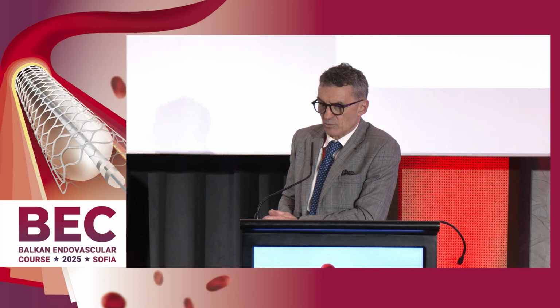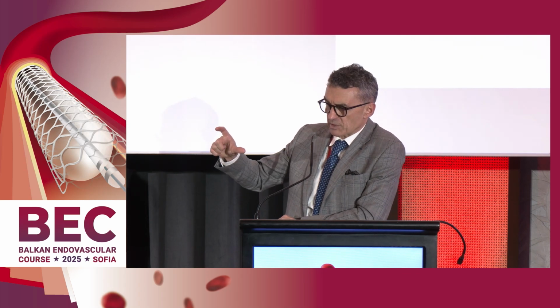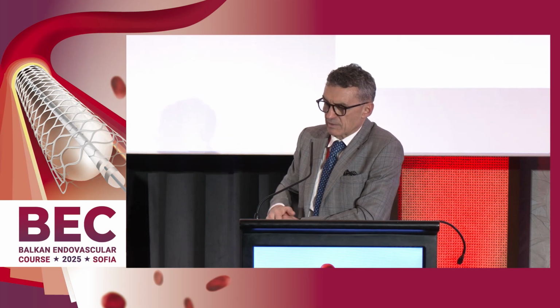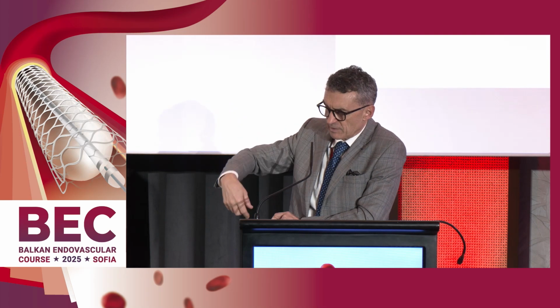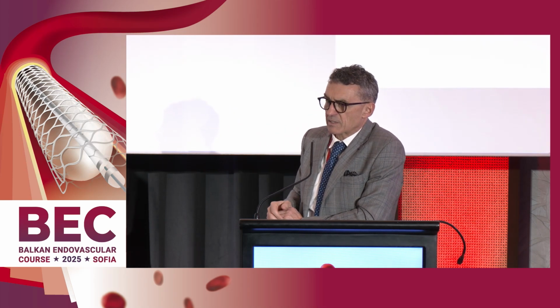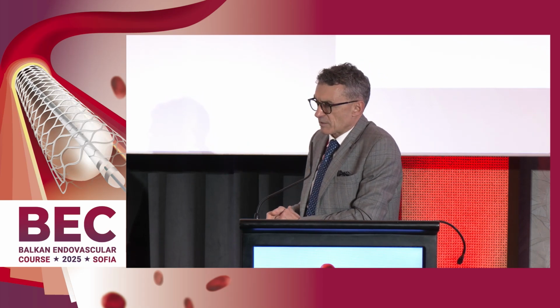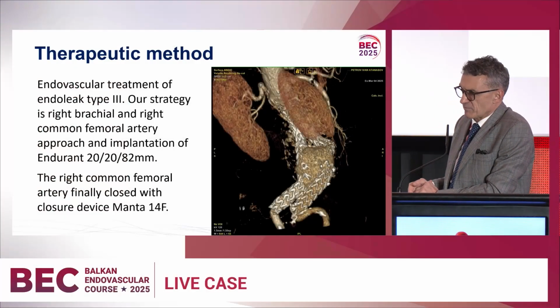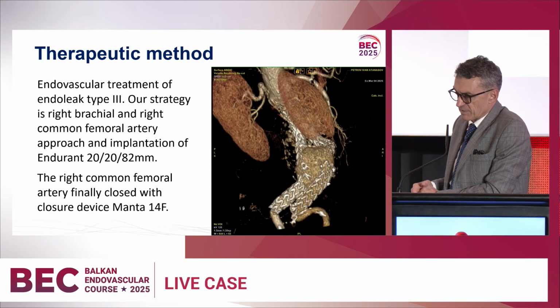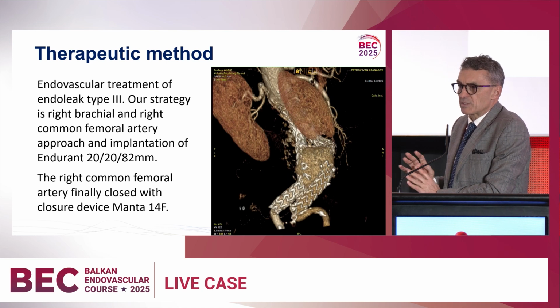In this situation the most straightforward approach is the telescoping technique: to put another graft in between the Y graft and the migrated distal graft, and reconnect the modules of the main graft and the migrated graft.